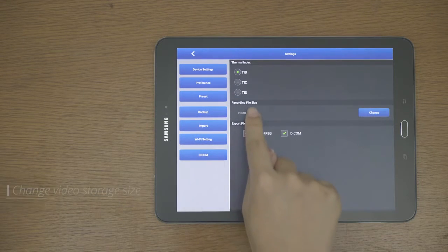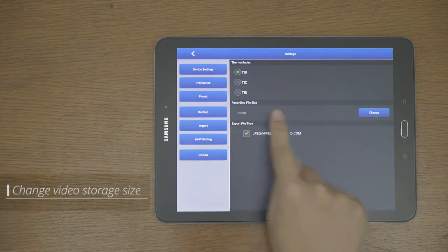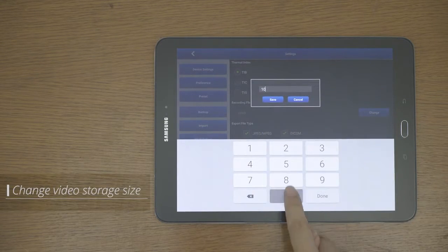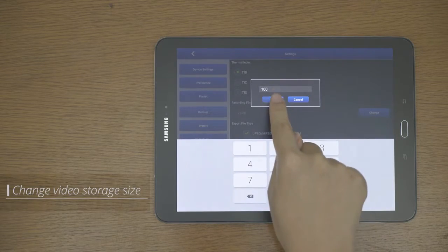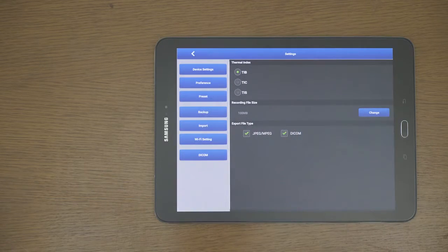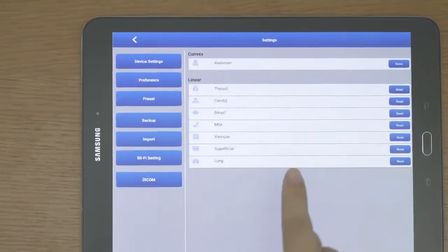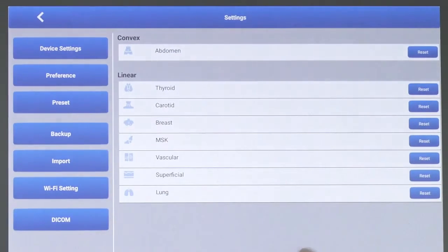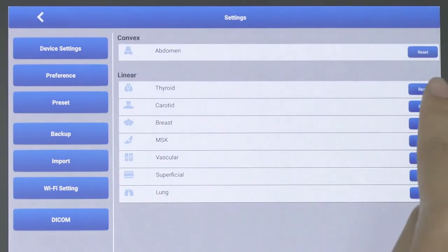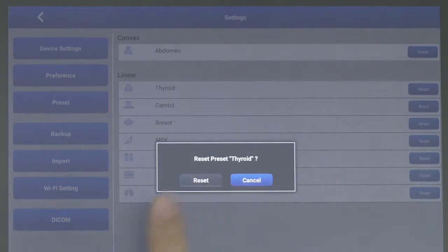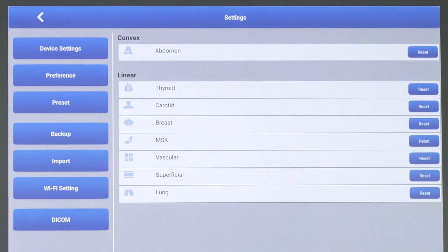In the preference screen, you can change the video storage size. In the preset screen, you can return the preset you created or modified back to its original value and even delete it.